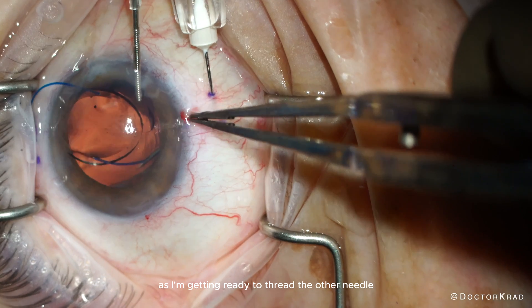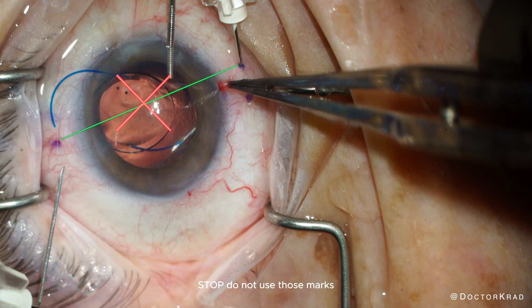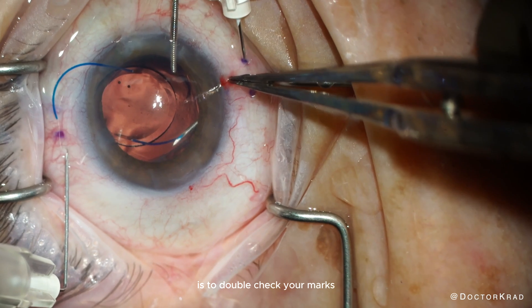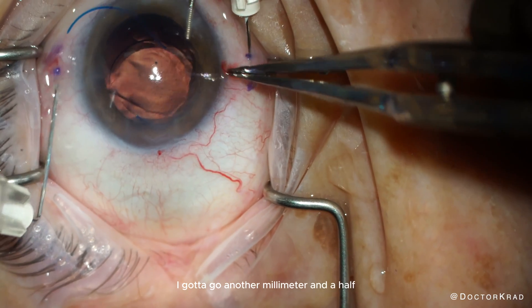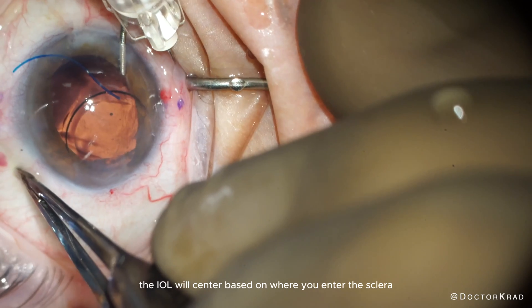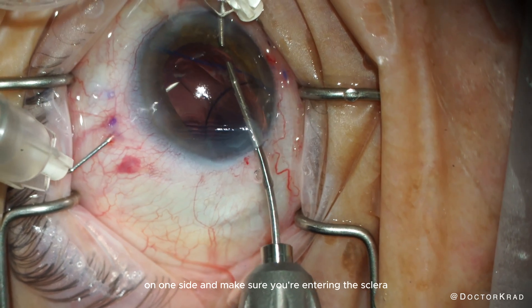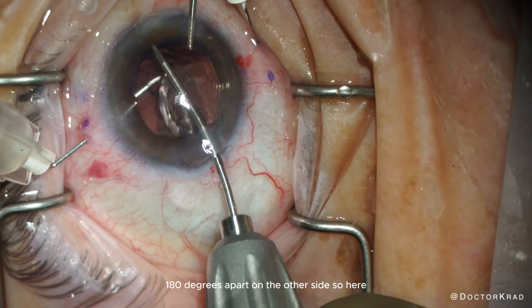As I'm getting ready to thread the other needle, I notice a big problem. Stop — do not use those marks. The conjunctiva has moved. One very important pearl for the Yamane technique is to double-check your marks prior to inserting the second needle. To center the IOL, I need to go another millimeter and a half counterclockwise from my original marks. The IOL will center based on where you enter the sclera, not the conjunctiva — so you must confirm the two scleral entry points are exactly 180 degrees apart.